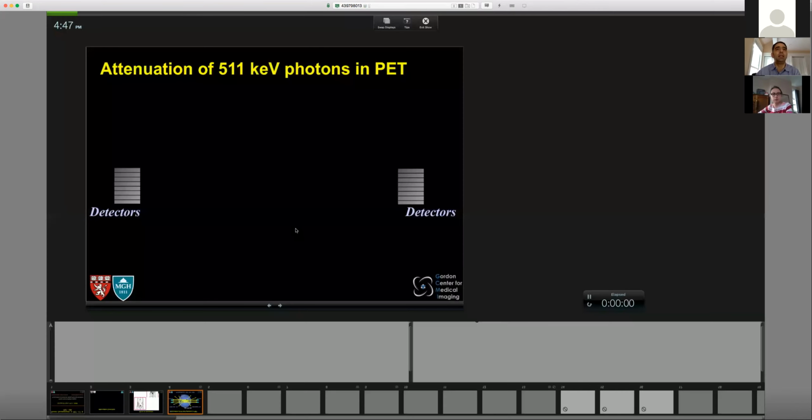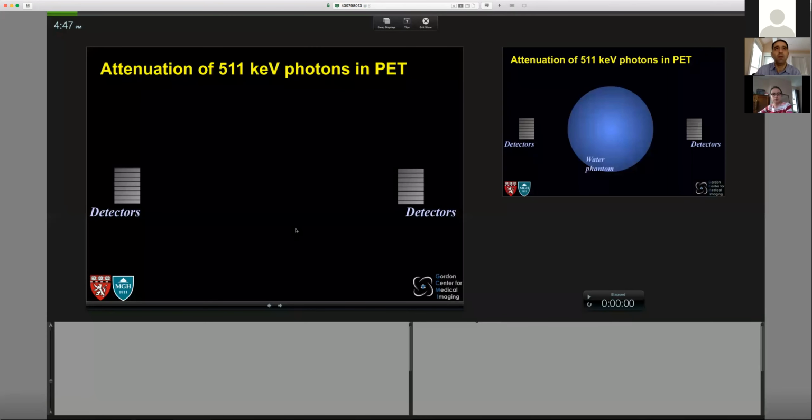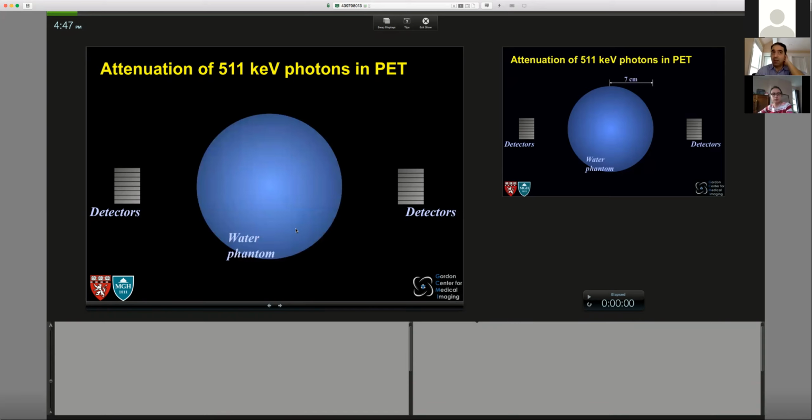If I had some detectors and a tank of water, and in that tank of water I had eight sources that are all emitting positrons, so they are annihilating into 2 photons, emitting 2 photons back to back from every one of those sources. Let's say from the first source, I emit 1, 2, 3, 5, 6, you name it, photons.